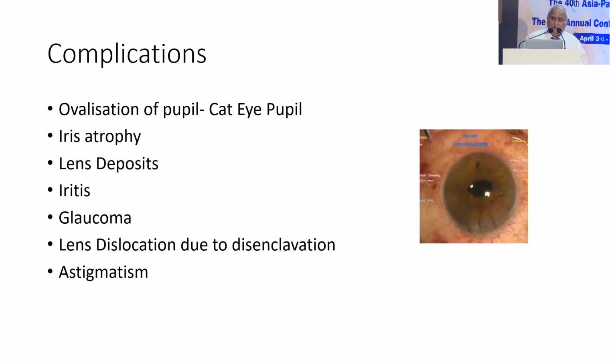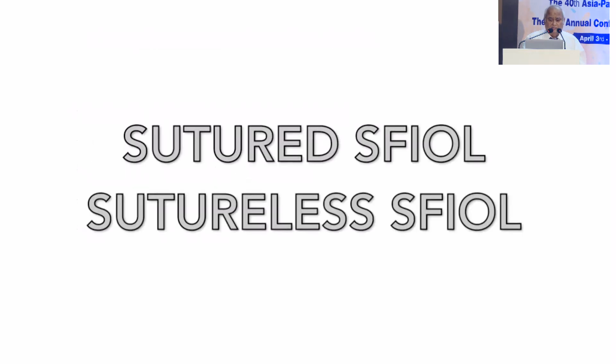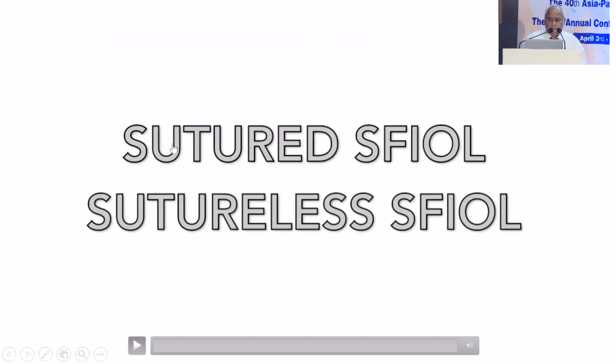अभी हमने आयरिस क्लॉ पढ़ाया तो कल से आप शुरू ना कर दीजिए. अगर आप स्क्लेरल फिक्सेटेड लगाते हैं तो वो भी उतना ही अच्छा है, और अगर एंटीरियर चैम्बर आईओएल आप अच्छे से लगा ले रहे हैं तो वो भी बहुत अच्छा है. ऐसा ना हो कि वो पीछे गिर जाए. So these kinds of things can occur, and all these complications have already been discussed by Professor Aparajita.